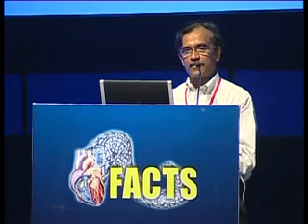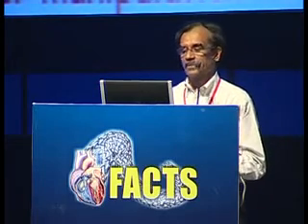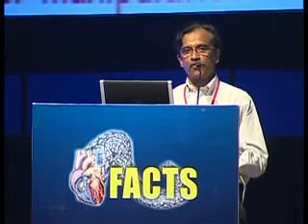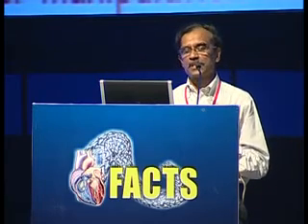And not only that, if your catheter is quite deep in the LA cavity, when you advance the spring stylet, the only maneuver to cross the stenotic mitral valve is gently pulling back, so that you need not push the catheter forward, just withdraw the catheter. So one of the main important points is to position the catheter initially deeper in the left atrial cavity. This positioning will help in avoiding the left atrial appendage, especially if the patient has a left atrial clot and you're forced to do the mitral commissurotomy for some reason, because the patient is not fit for surgical intervention.